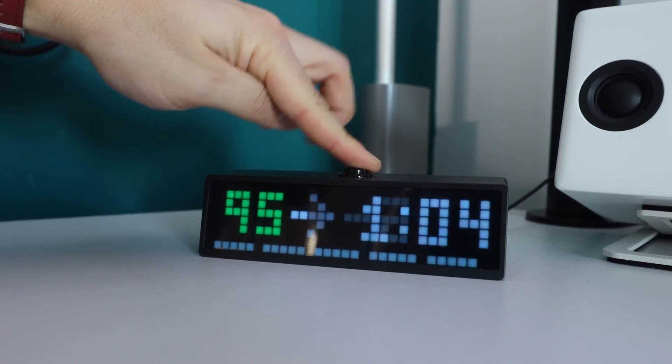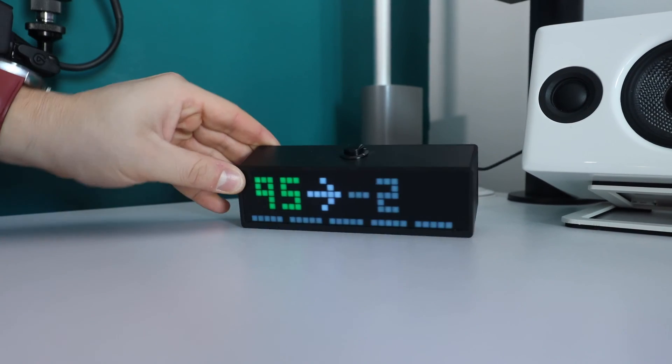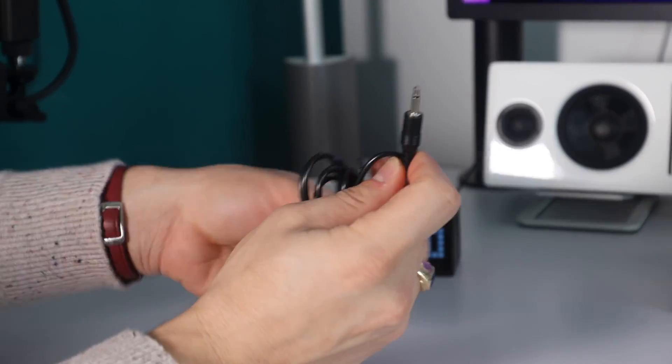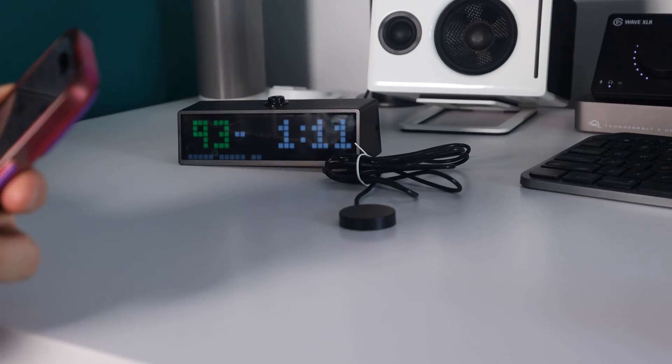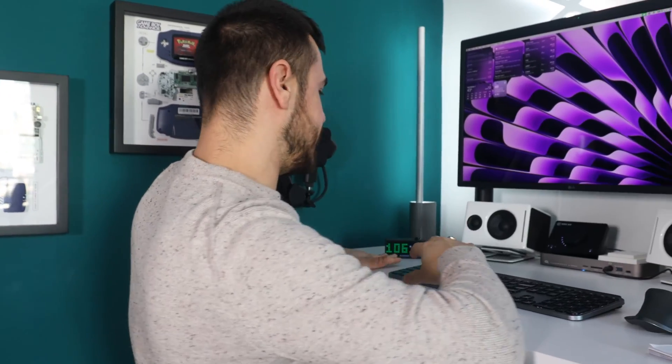You can choose when you want alerts to sound — that's going to wake you up. There's an auto snooze feature for when you're not home and a snooze button right on top. Aside from audio alerts, there's a vibrating puck included with the Sugar Pixel. This plugs into the back and it's pretty long. You can put it under your bed and it will vibrate and hopefully wake you up when there is something to address. I love having it at my desk while I'm filming or recording a podcast — I can just quickly glance down, see my blood sugar levels, and just know that I'm good.